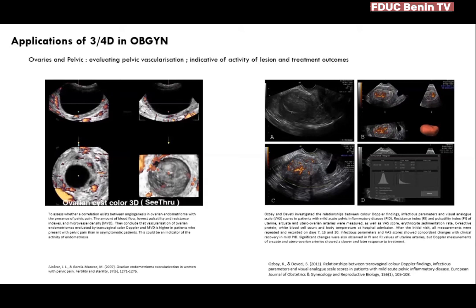Again, the clinical utility of 3D, 4D should be dependent on the clinical scenario and the intended clinical question to be answered. In this case, we can see multi-planar modes overlaid with power Doppler to understand the vascular characteristics of the lesion in question.